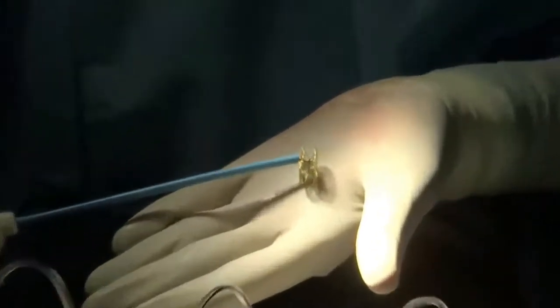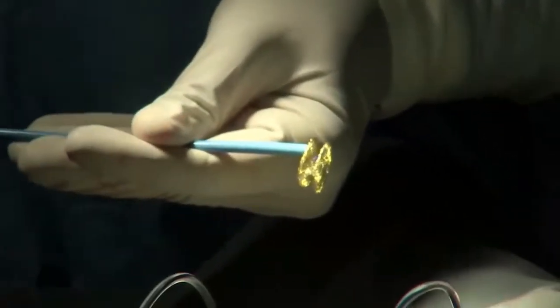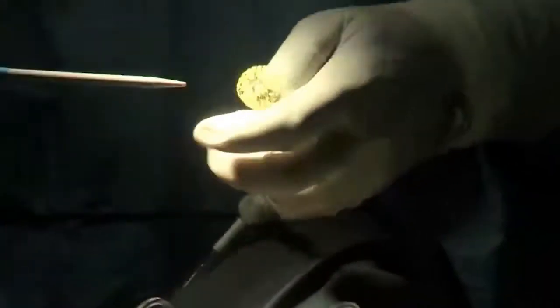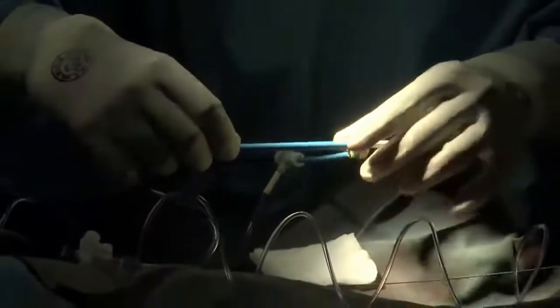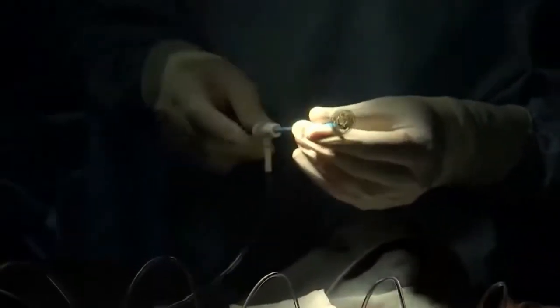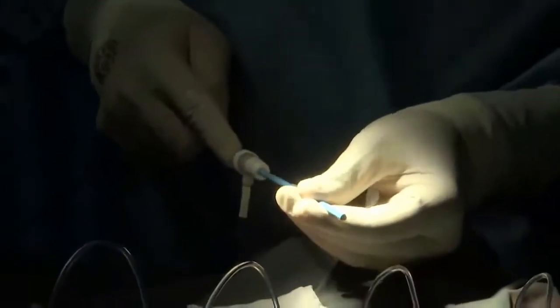So what I have done is I have taken one Prolene stitch, show that dilator. I have taken it around 5 millimeter. So this is 5 millimeter, and I have made it a snug fit for a 5 millimeter. So now we are going to load the device into the sheath. I will do that now underwater.